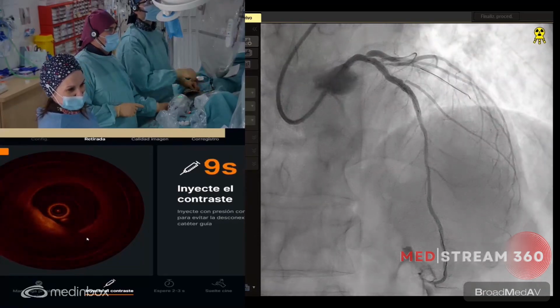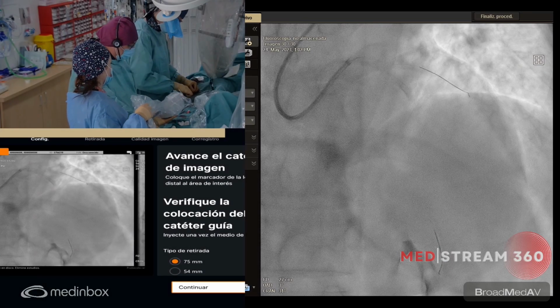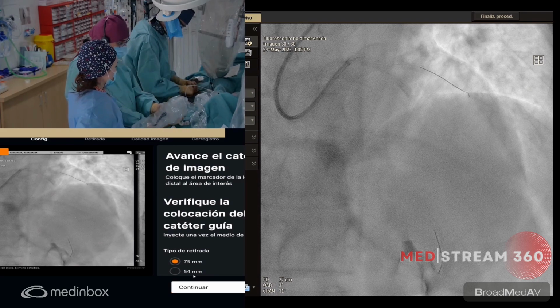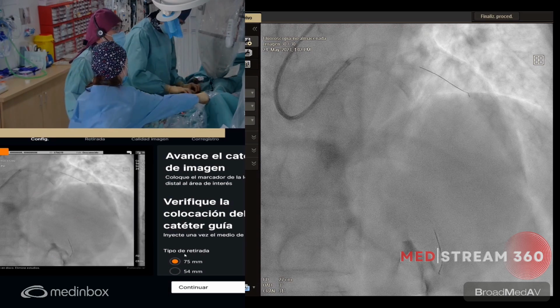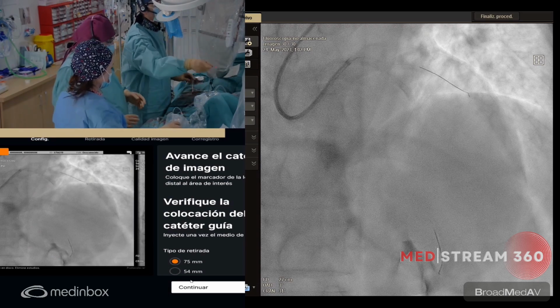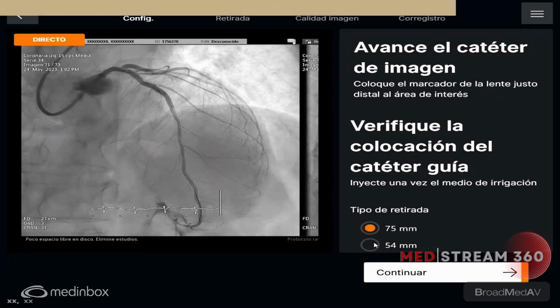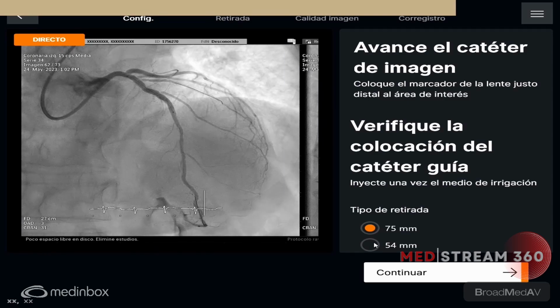No, something is wrong with the catheter. And the lens is broken because of this struggling in the advancing, and probably we need to open another one or trust in the angio. Yes. Let's check with the last cine we did. We believe the angio.